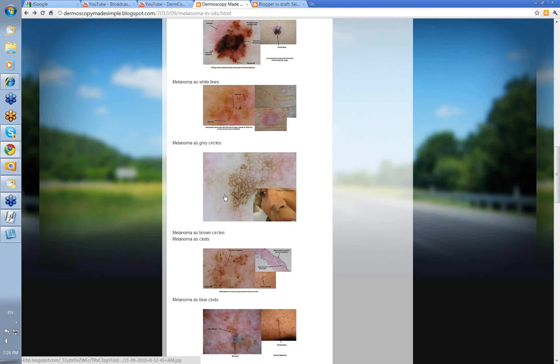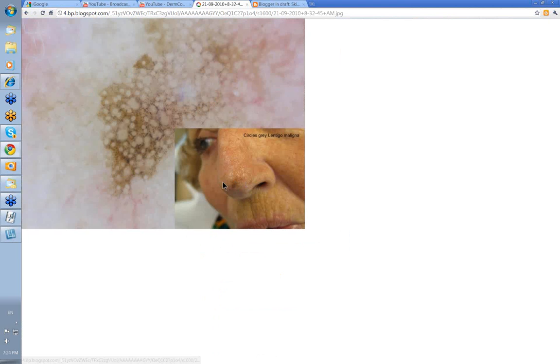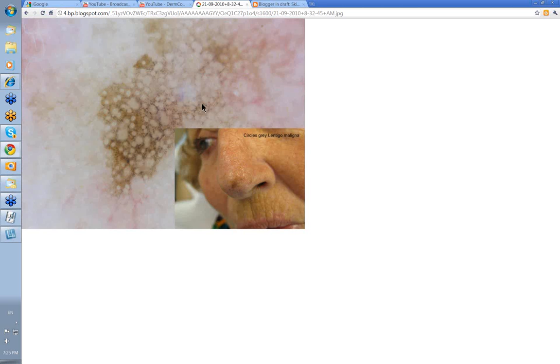What about melanoma's grey circles? We've shown you this one before with grey circles. That's the clinical lesion here on the nose. These are grey dots around the follicles giving you the grey circles.